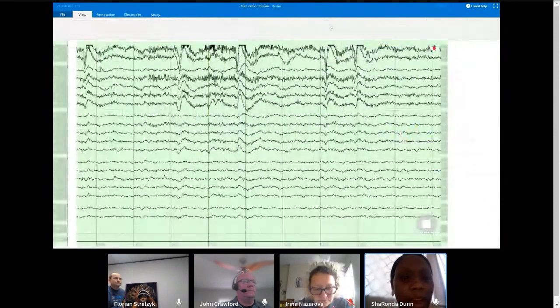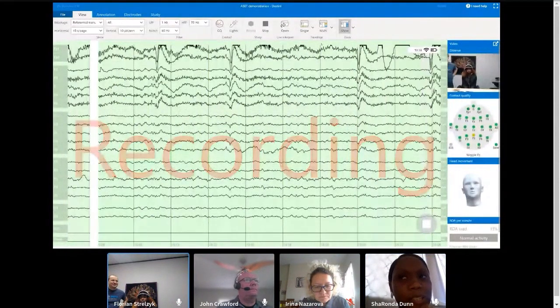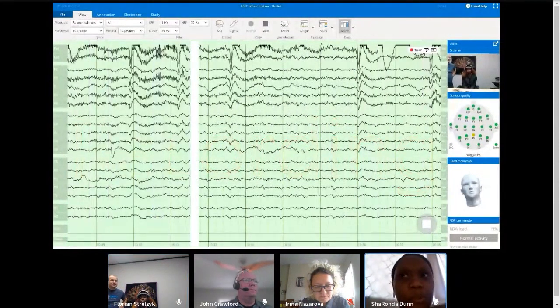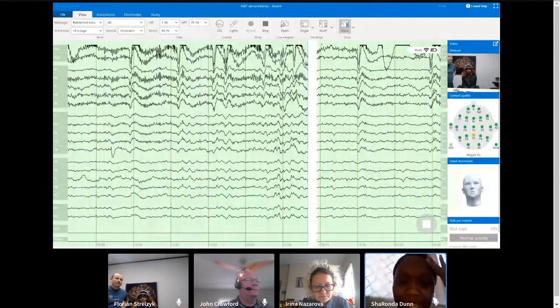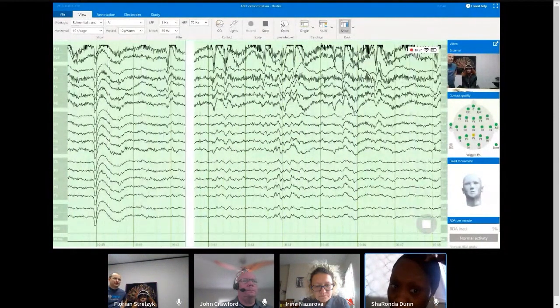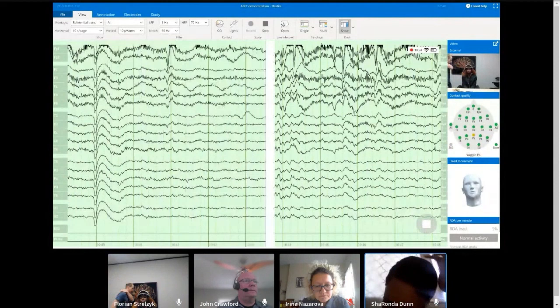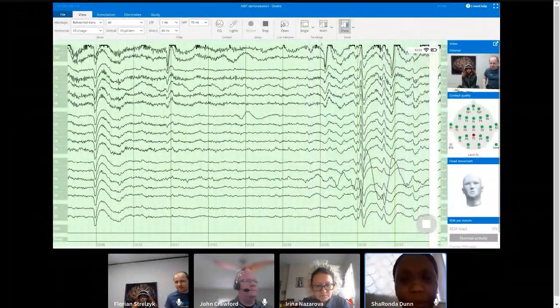How do we go about that? Because I encounter patients whenever I'm trying to do an EEG, and it was always hard to get them to stick. Or a patient that wore a wig and it wouldn't come off from this area right here. How would we handle those situations?